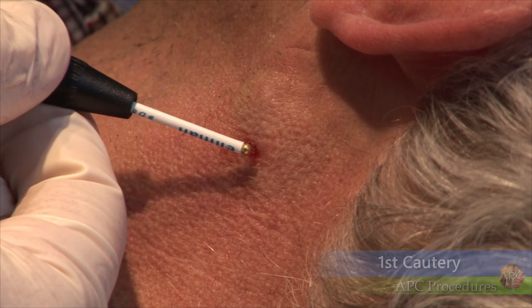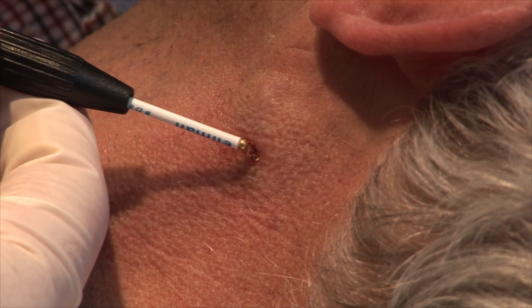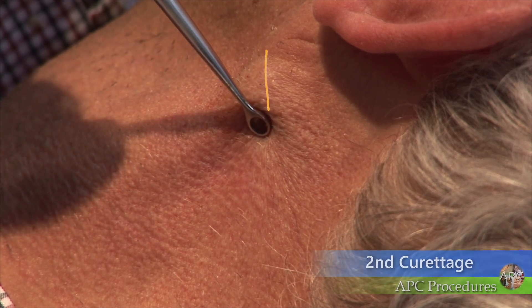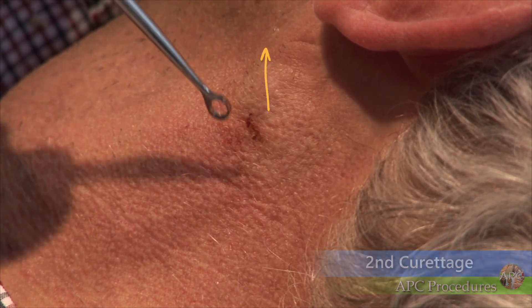Four rounds of curettage and cautery are performed to ensure that the process eradicates any superficial dermal extension of the basal cell cancer. The lesion is curettated in four directions, with cautery being performed with each series of curettage.